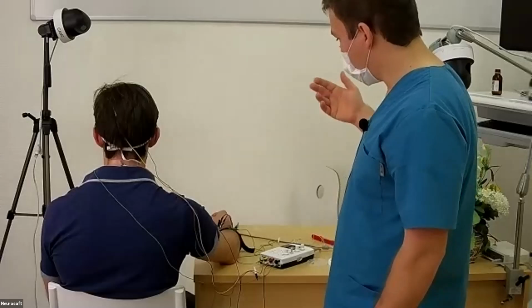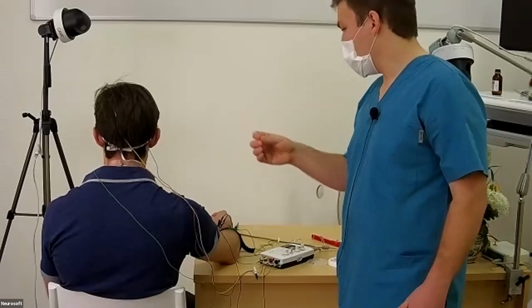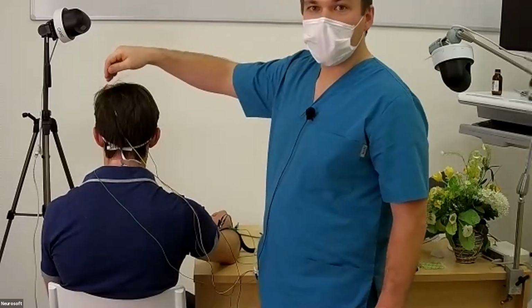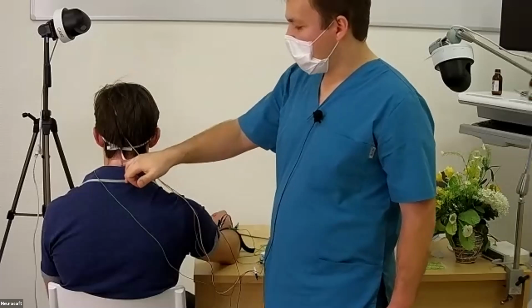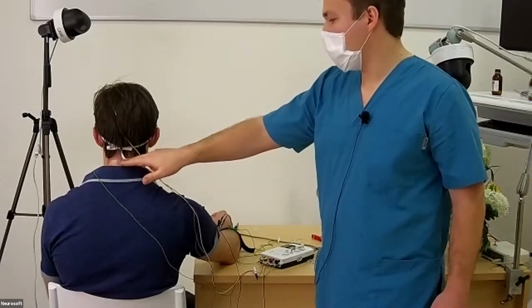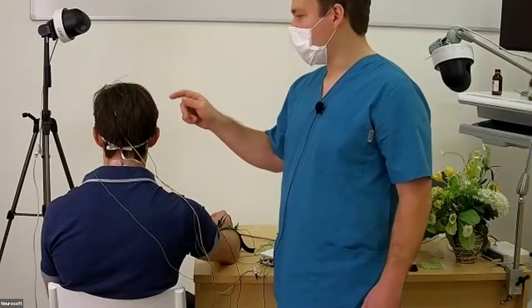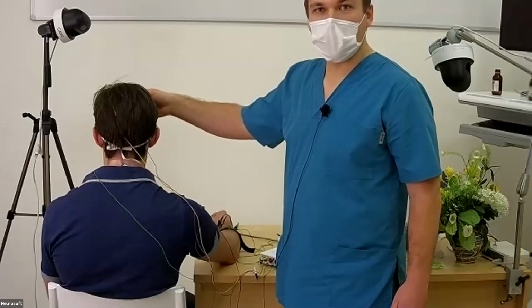This time we register somatosensory evoked potentials from the median nerve. We set the contralateral primary sensory cortex, and C5, C6 at the spinal level, and both of these channels are registered to the reference Fz electrode.